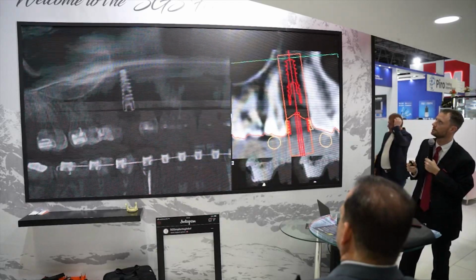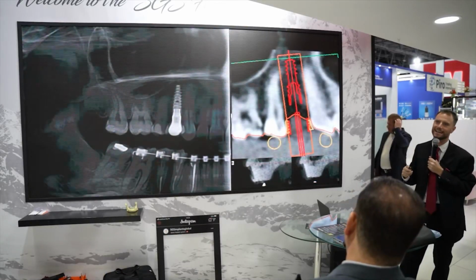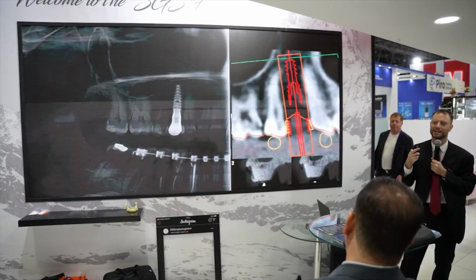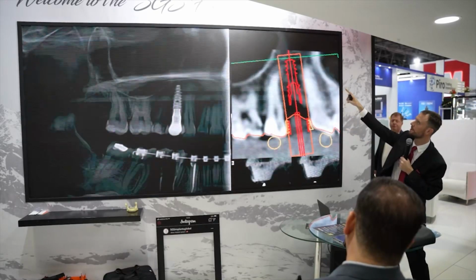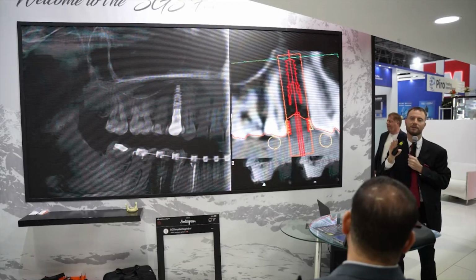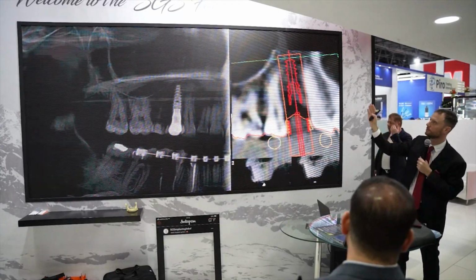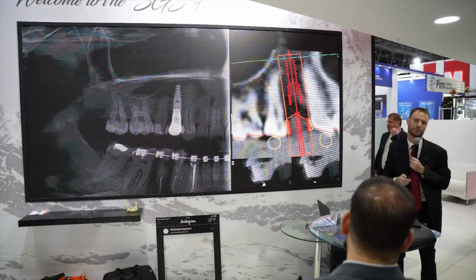Critical is that you have all the threads and everything for the implant, so you can exactly plan your implant position. But I like, as I told you with the orange line, to warn you about the distortion. We had 1.5 millimeter on average, so in all software, be aware that you need to have a security distance.